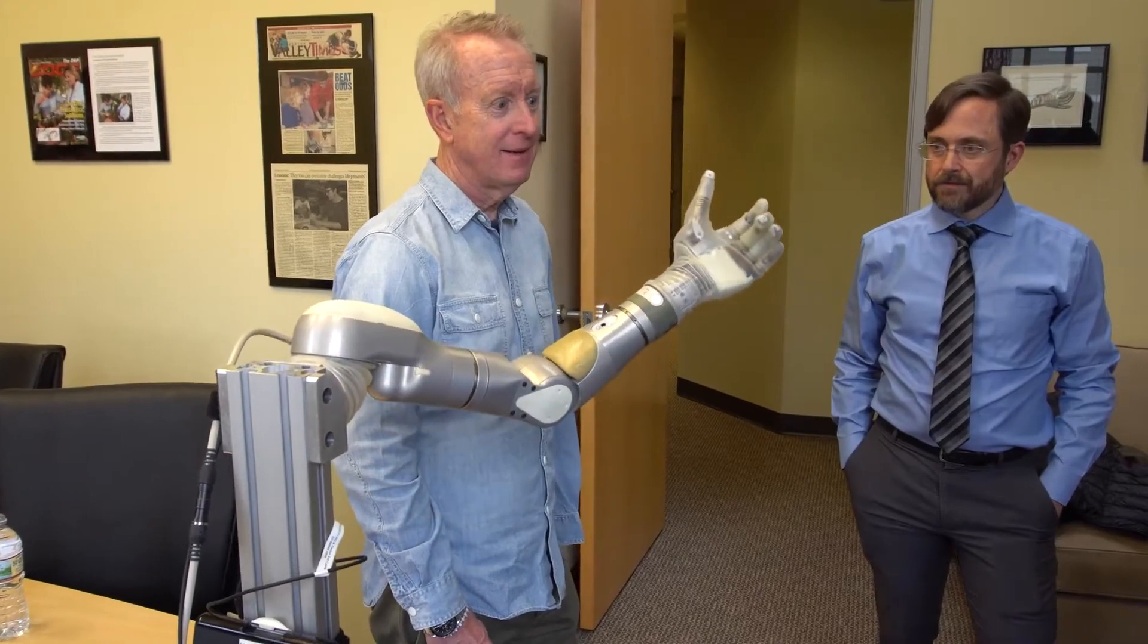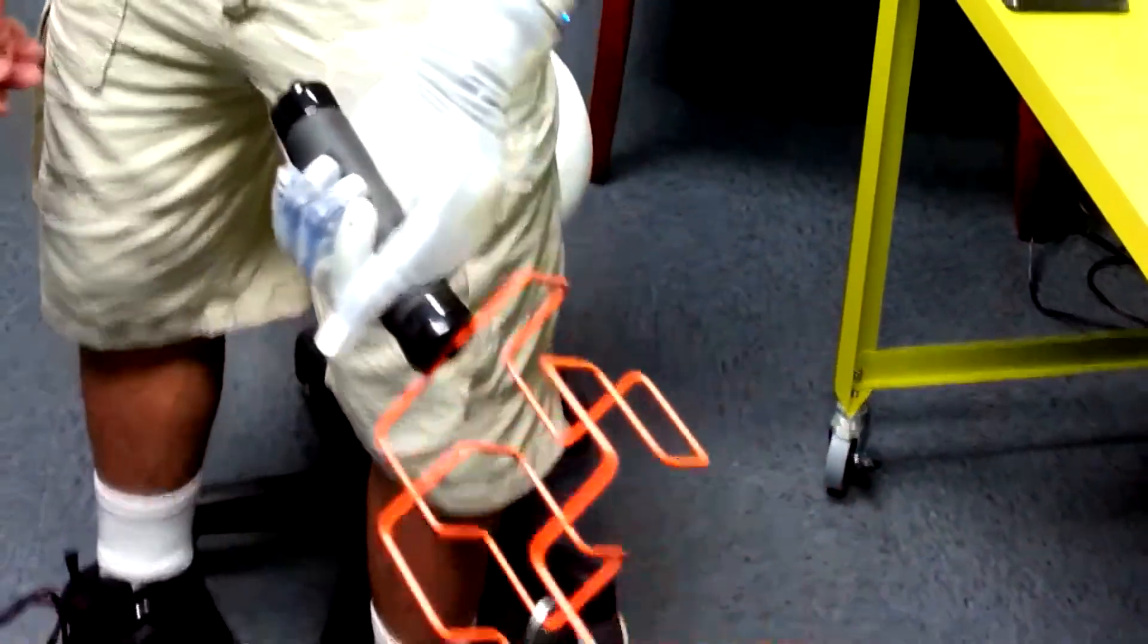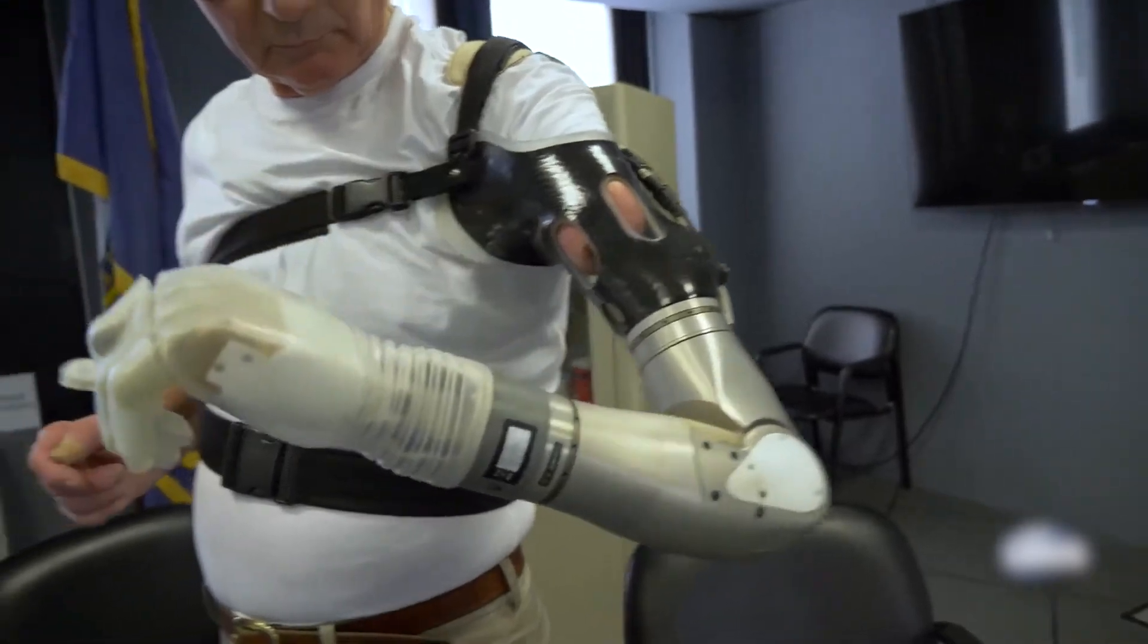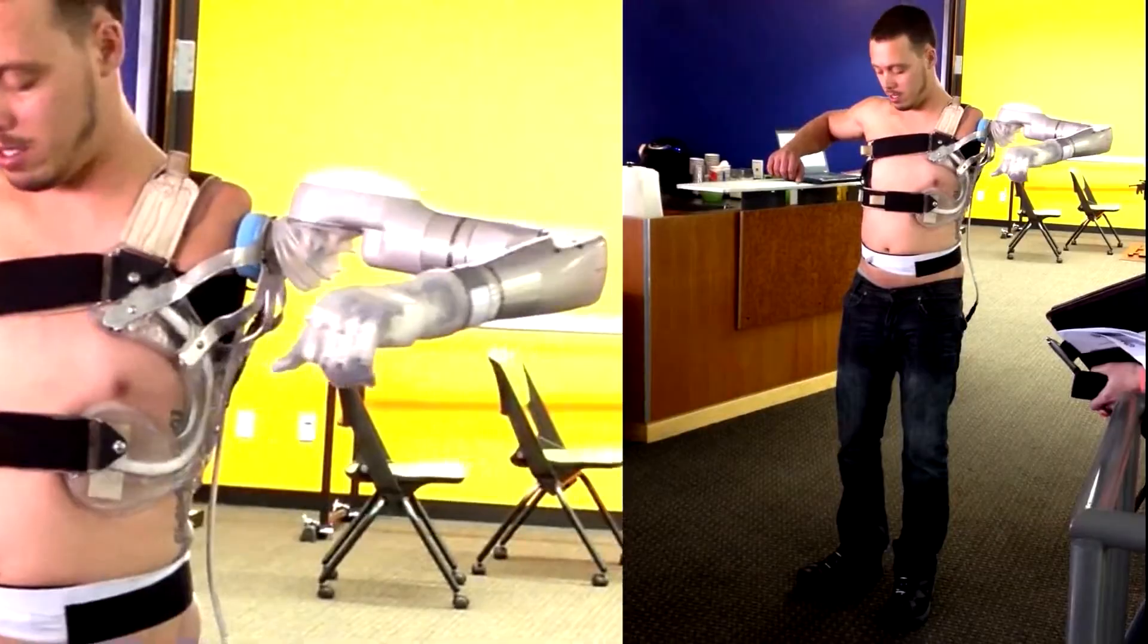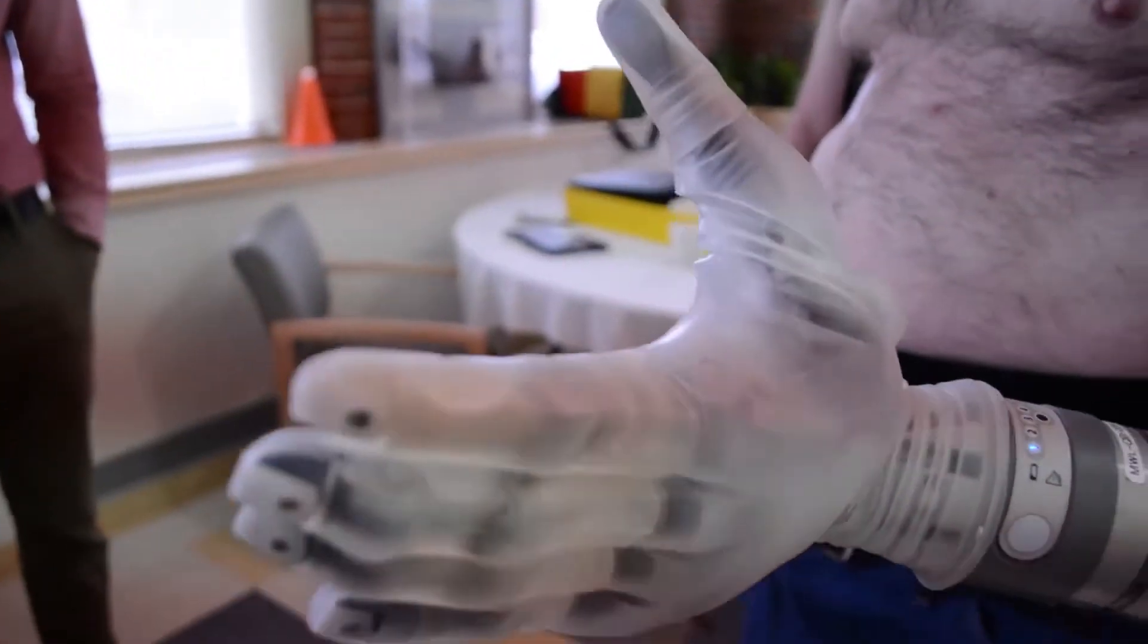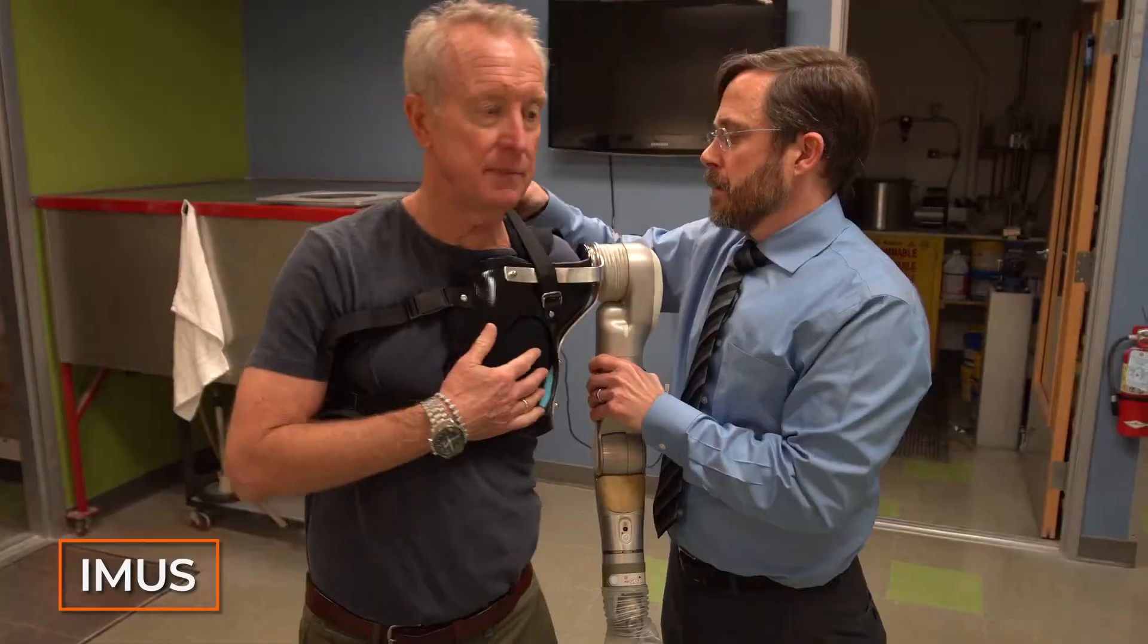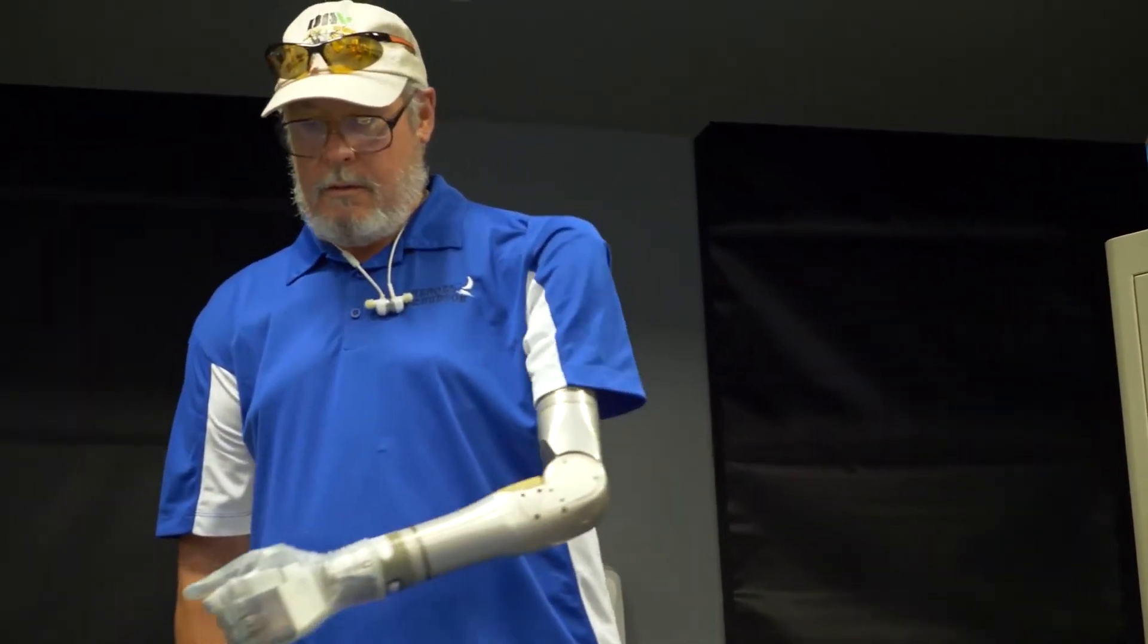The arm is also strong enough to lift a bag of groceries from floor to a tabletop and even gives users a sense of how firm they're grasping something, thanks to the built-in sensors. But the most impressive feature is probably its ability to reach all the way back and scratch your back when you need it. It's all controlled from input devices like EMG electrodes and pressure switches, but it's also possible to operate via wireless IMUs that you wear in your shoes. You and the clinical team will work together to develop an input configuration that best meets your needs.